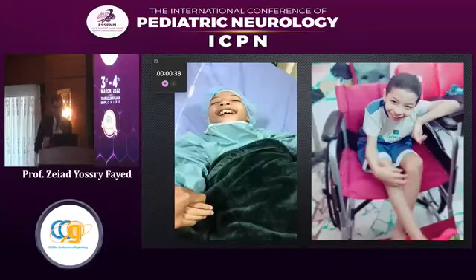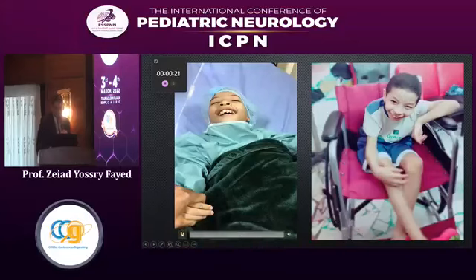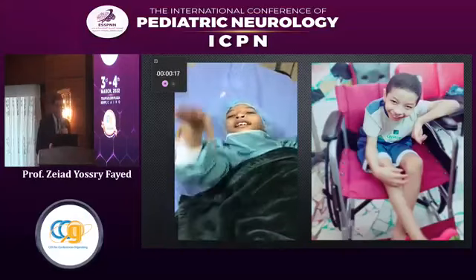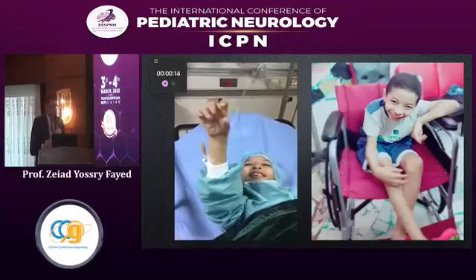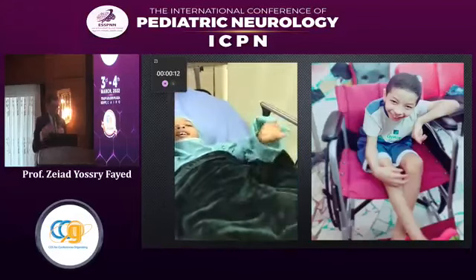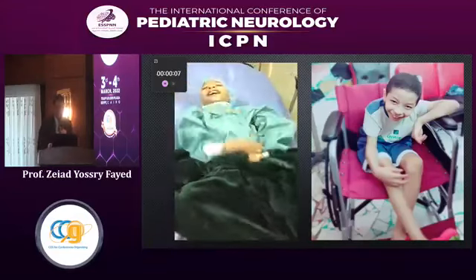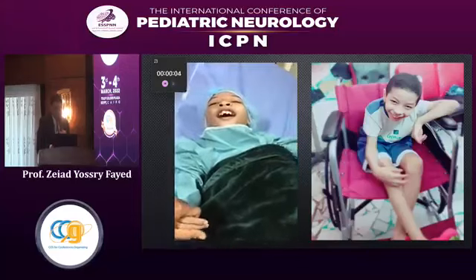This is our patient. He had DYT28 dystonia. I couldn't find many videos, but in this one we can see the characteristic facies and the, not microcephaly, but the small dimensions of his skull. And this is the patient just before surgery, on the morning of surgery. He almost couldn't speak, and he was wheelchair bound, and he had been progressing in the three or four months before deep brain stimulation. The patient had deep brain stimulation.